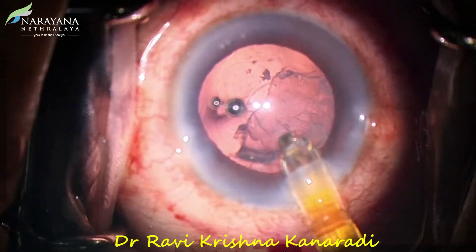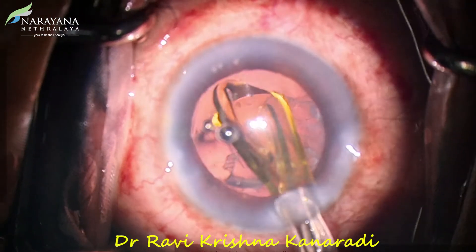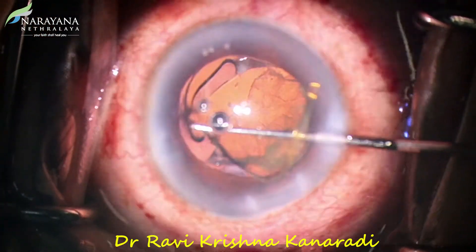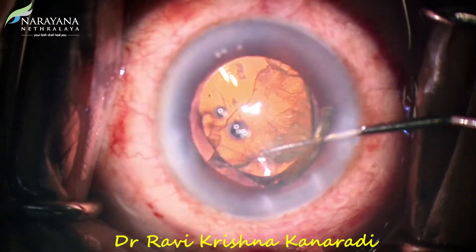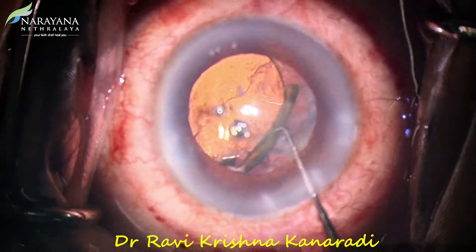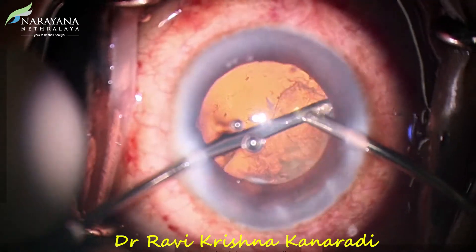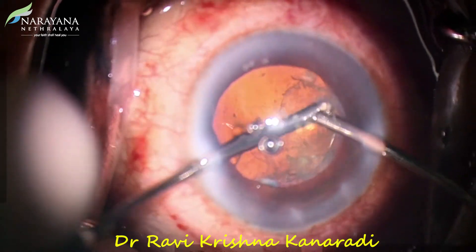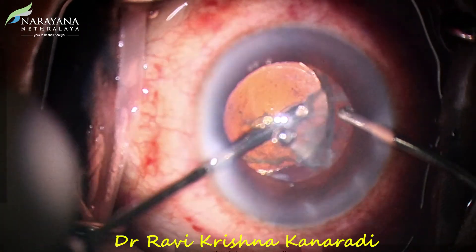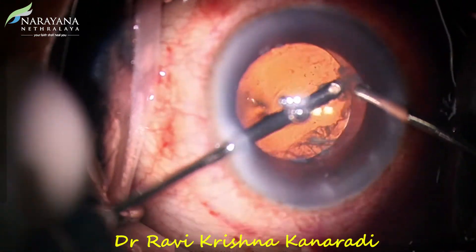A single-piece foldable hydrophobic IOL was placed in the bag. The trailing haptic did not go easily into the bag, so I preferred to fold the haptic using a Sinski hook and release it gently in the bag rather than forcing it. Removing the trapped cortex after CTR insertion is a little difficult; using a tangential motion stripping technique makes this easier.